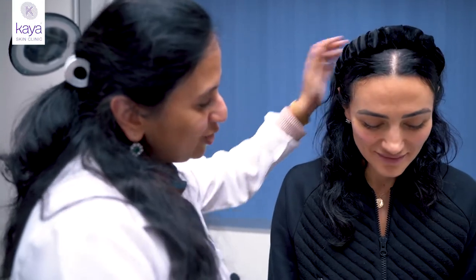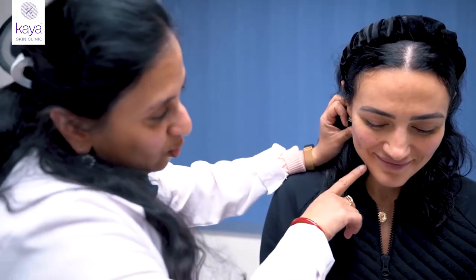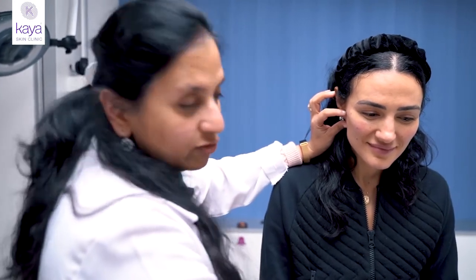We have Ivana with us here and she feels that there's this little sag coming onto the face, though she's gorgeous. So all that we're going to do is do little threads to just pull this back and hold back the skin as well as the soft tissue.